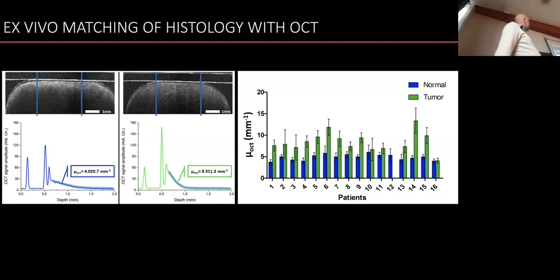It was really cool. Here you think we visualize the whole kidney. That's not the case. This is just a tiny part of the kidney, about 5 millimeters. Due to our acquisition strategy, it curves off on the side, but we were at least able to study the tissue and again analyze attenuation coefficient. And we showed there was a clear difference again between normal and tumor, but also between benign and malignant cancer. And that was nice.